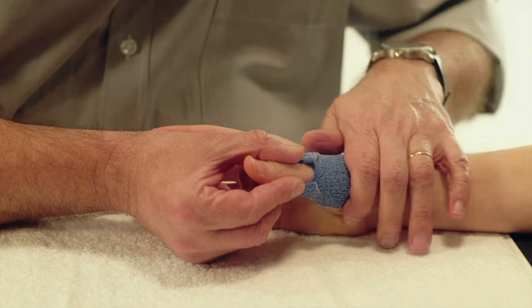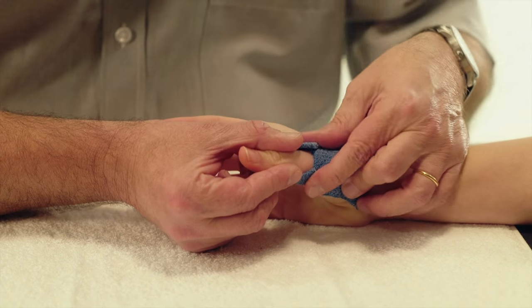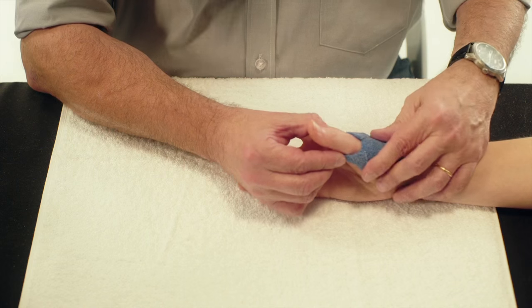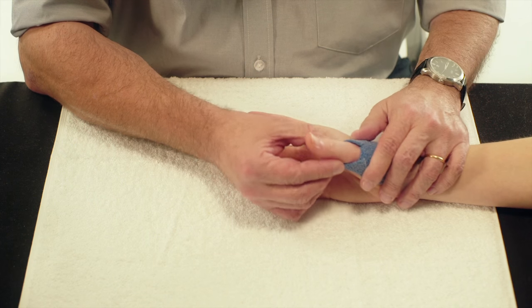Mould the palmar side of the orthosis to the thumb and return the edges towards the dorsal side. Keep the thumb in abduction during the entire cooling time.